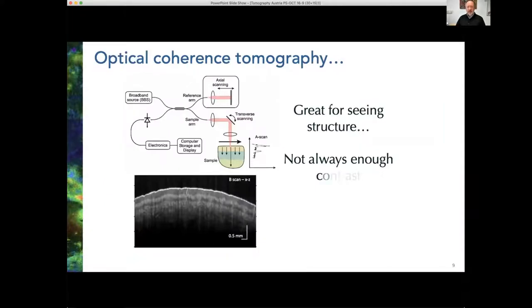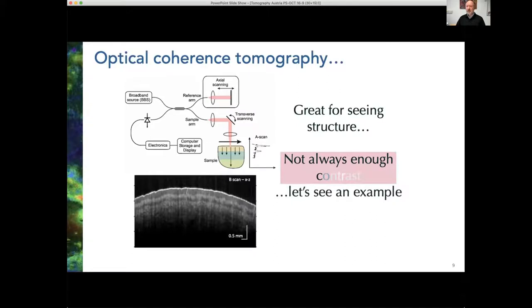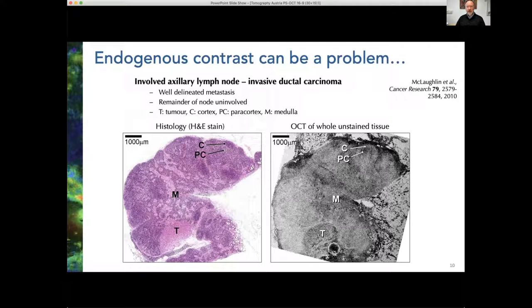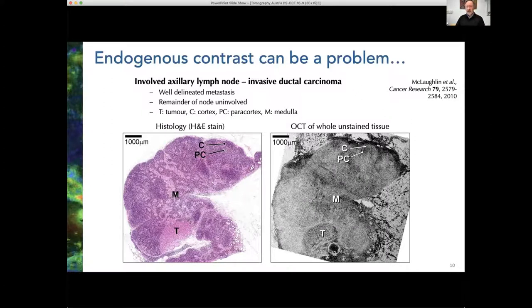At the same time, OCT is great for imaging things which are quite transparent, but it can be challenging to get enough contrast. This example shows histology of a lymph node with invasive ductal carcinoma. The histology image is a five-micron thick slice processed and stained with haematoxylin and eosin. The OCT image on the right is a section taken from a volume of tissue — you can map structures quite effectively, but it's very difficult to a priori identify what those structures are, coming down to a lack of specificity and contrast.